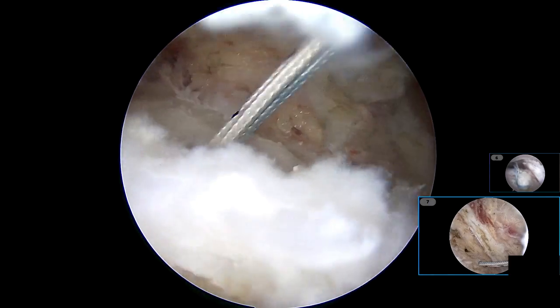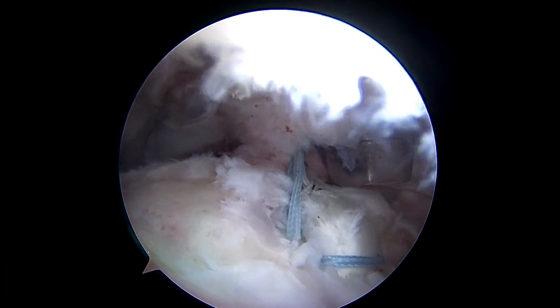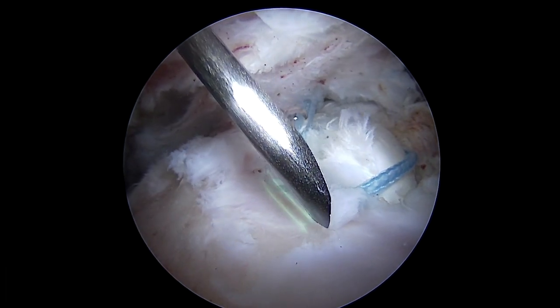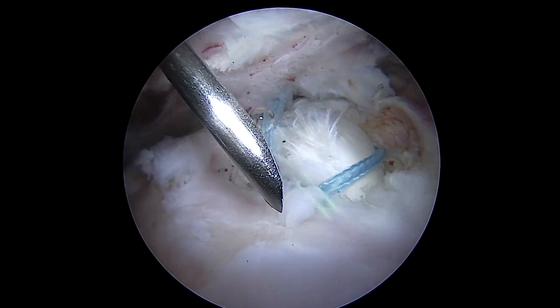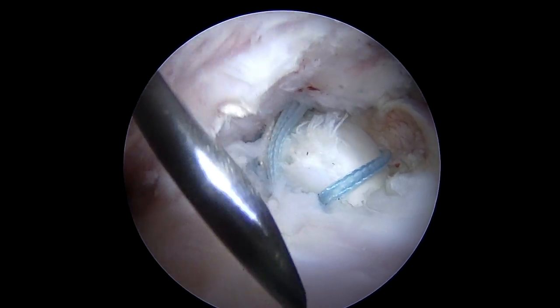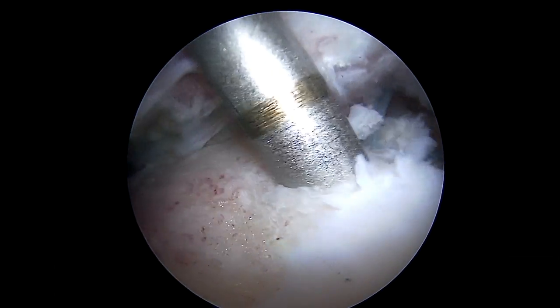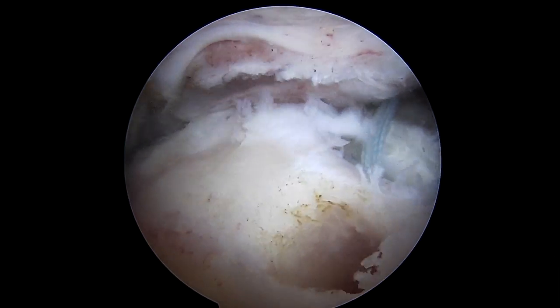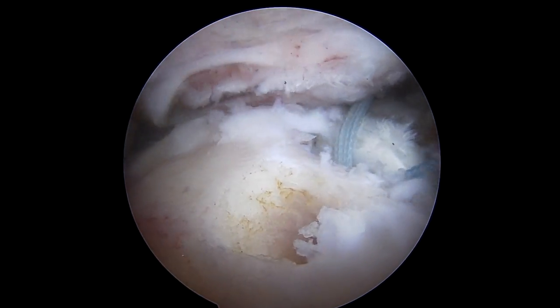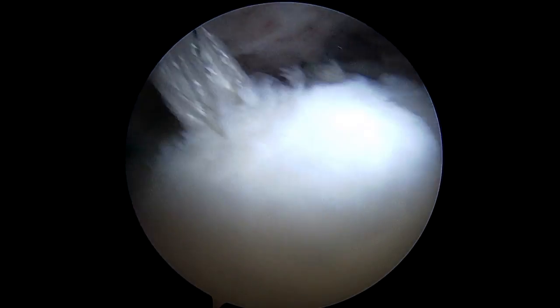Now we're going to put the greater tuberosity anchors on the medial aspect of the tuberosity. With such an overhang on his acromion it's hard to find a spot at the right angle. We're rather close to the tenodesis screw, so here's a little precautionary trick — we'll start out drilling a guide pin hole, so we're not going to crack out into that adjacent bone socket. We use the green handle punch, take it down by hand, then take our swivel lock punch. We've gotten very close to that tenodesis screw without blowing it out — tap until the first threads hit, then stop and turn. We'll leave all the stitches in including the safety stitch, then put one toward the back.